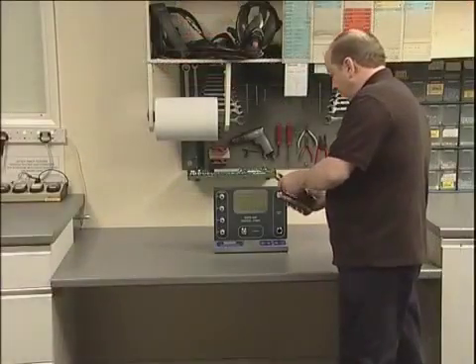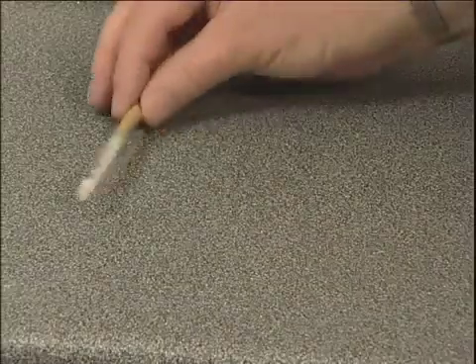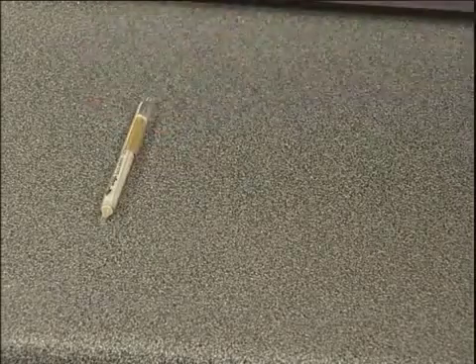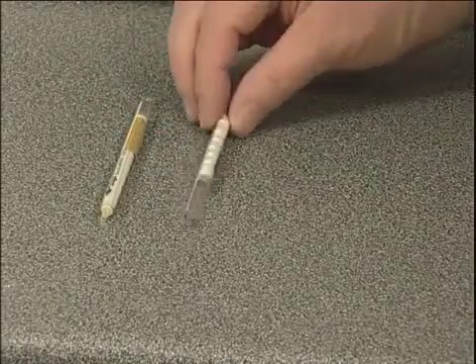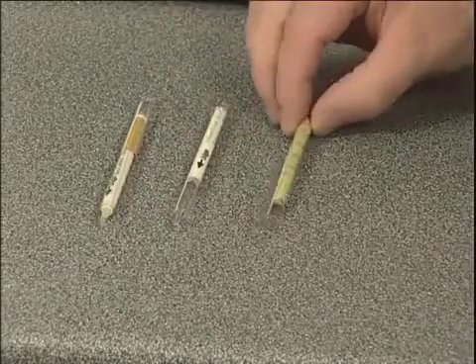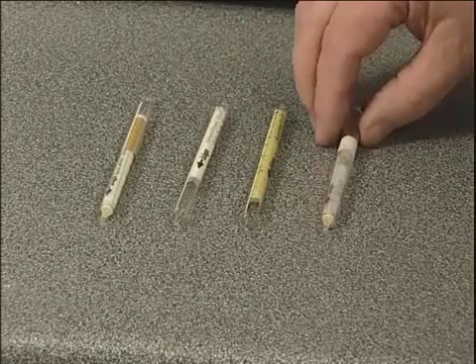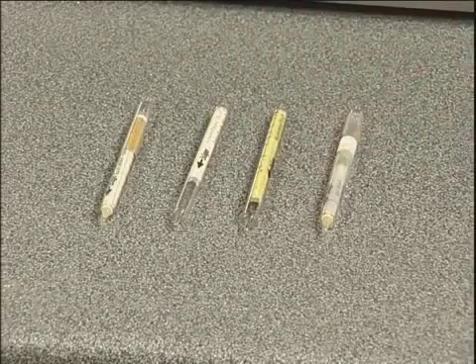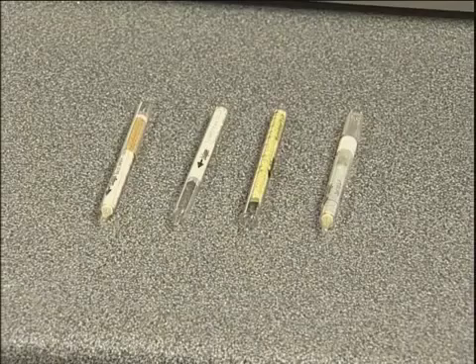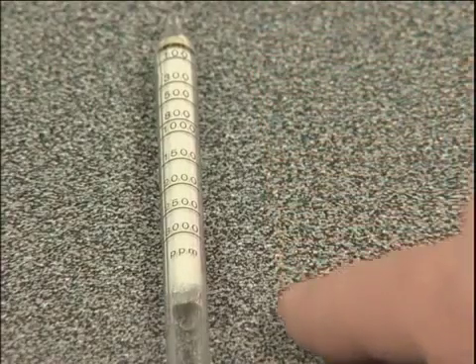The test is carried out using Draeger chemical reagent tubes, one each for carbon monoxide, carbon dioxide, water and oil. These are supplied in packs of 10 per type and in most cases show the degree of contaminant present as a colour change to the crystals that they contain. The extent of this is read against the scale on the tube.